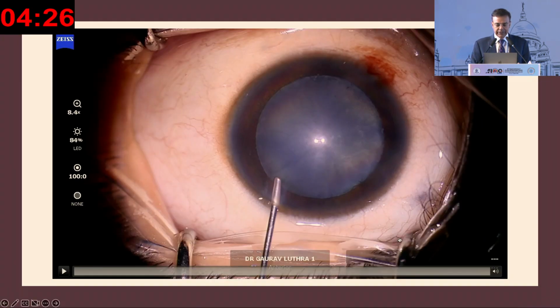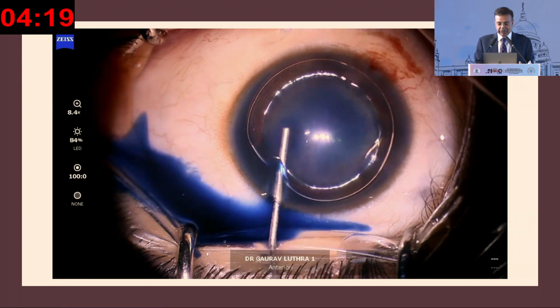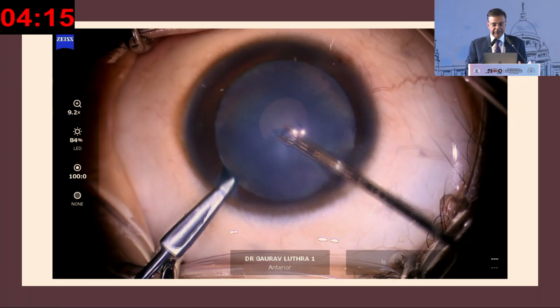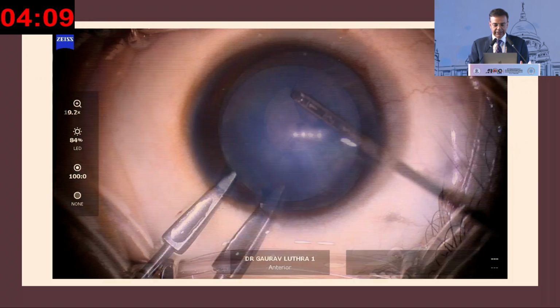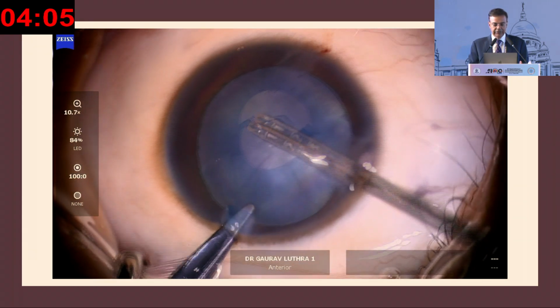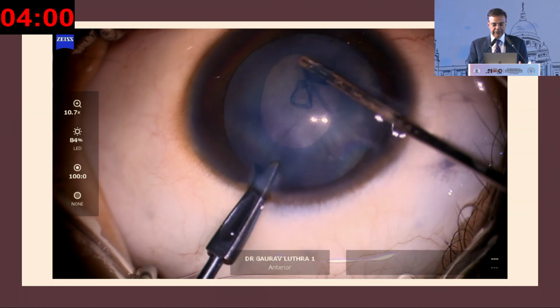Now this was another situation where to begin with it was a cataract surgery, and later on it became more of a surgery which required something which is the topic of the course today. So this was a pediatric cataract, and we started off by aspirating. This was a very intumescent lens, so once I started the rhexis, I did some aspiration of the cortex under viscoat, and you can see that I am now enlarging the capsulotomy to the desired size.